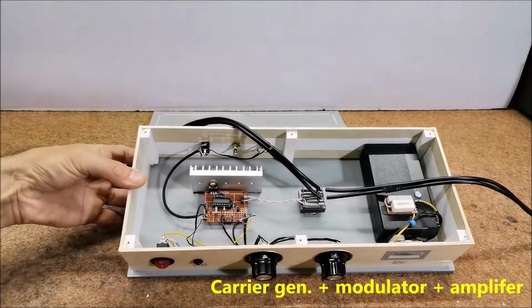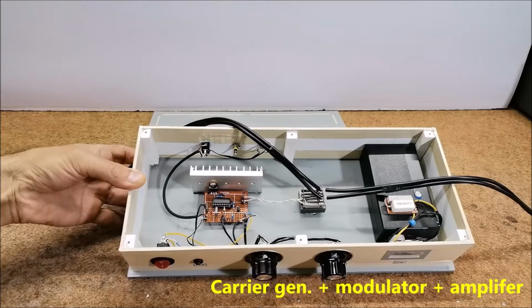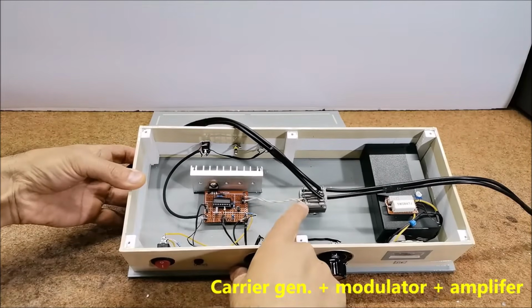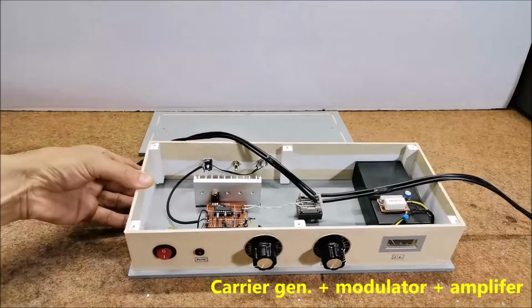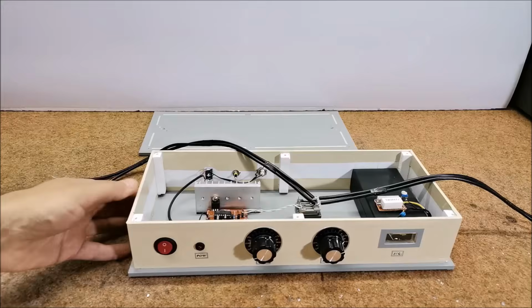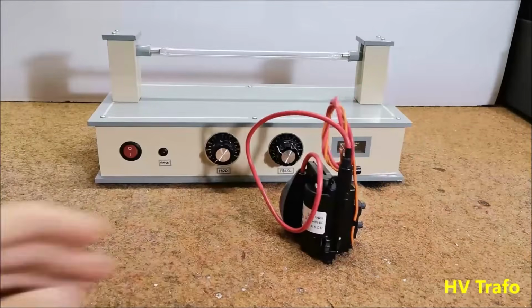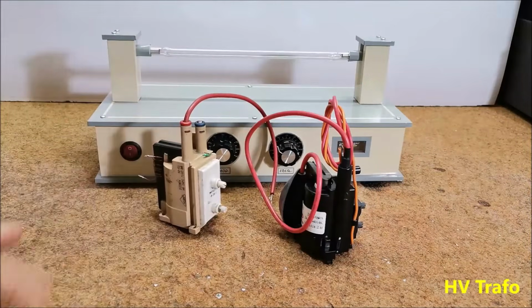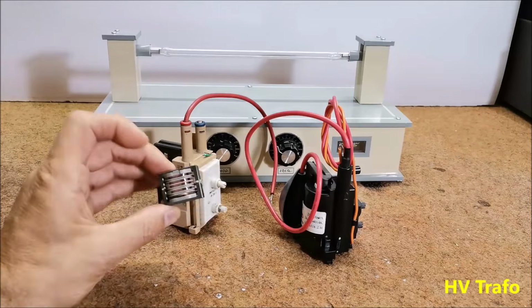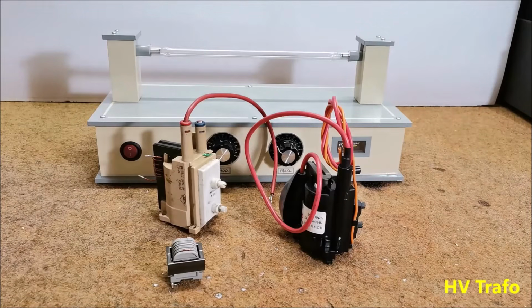Then this modulated signal is amplified by a power transistor, which is mounted on an aluminum board for cooling, and fed to the primary windings of a high voltage transformer. The circuit diagram for this part is given in the project attachment. Next, the high voltage transformer can be taken, for example, from an old CRT monitor or TV, from a copy machine, as in my case, or we can get it from an electronic parts store or online.